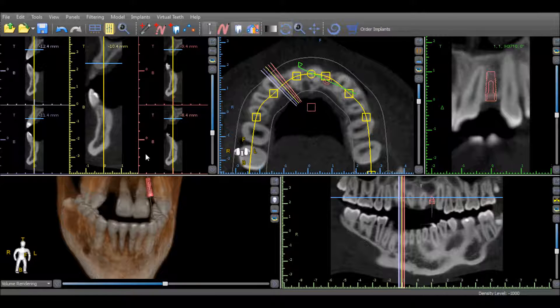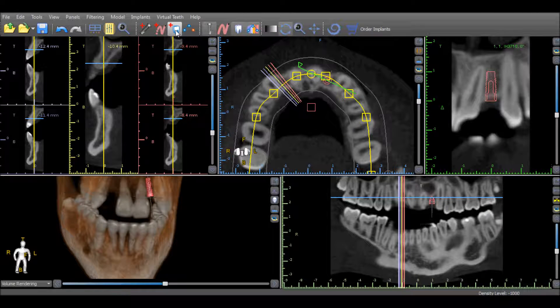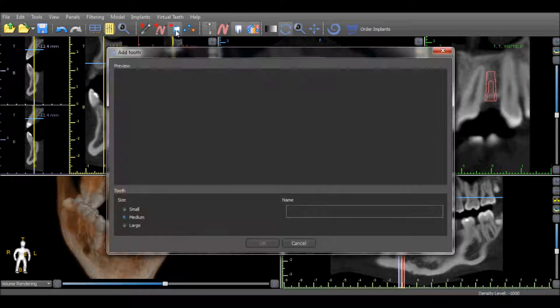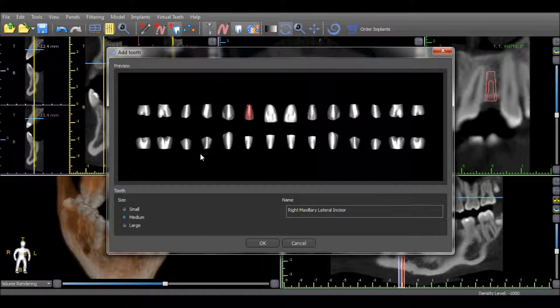A virtual tooth can be added to the treatment planning by pressing the Add Tooth icon in the horizontal toolbar. The desired tooth should be selected, the approximate tooth size should be indicated, and the OK option should be pressed.